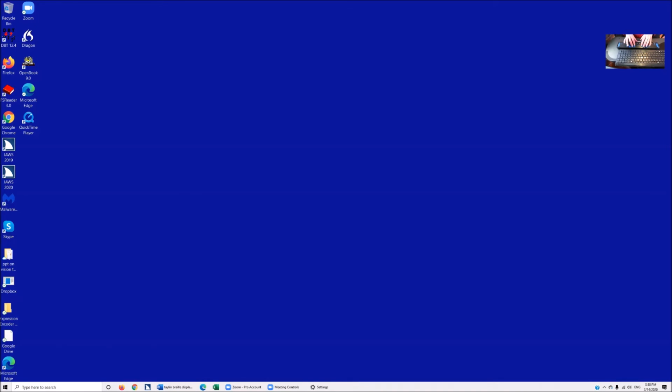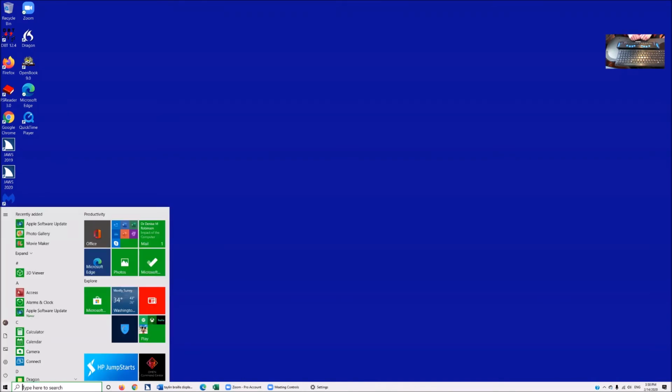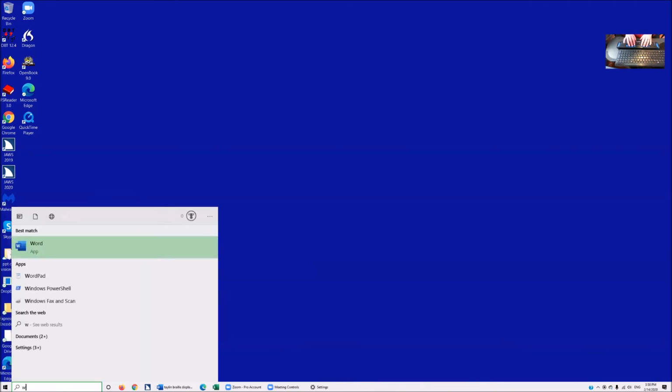Off. Beautiful. Okay, so the first thing I'm going to do is I've got my little shift buttons directly below my space bar. And my right shift and .4 is going to open my search menu. Search box edit, type in text. Okay, so let's say I want to go to Word. I could do it this way. W, Word, O, Word, app. We love that. Okay, my pinky is sitting on .8. I'm going to hit enter on that.